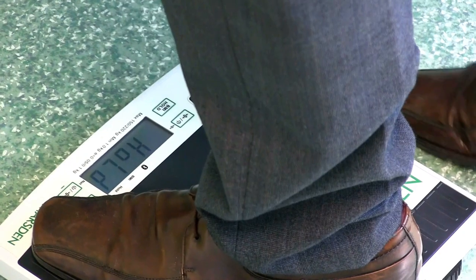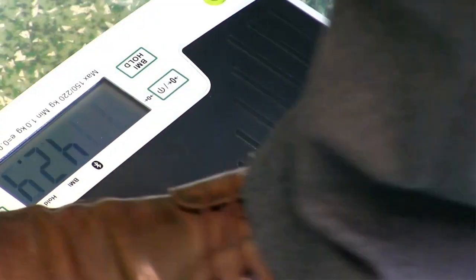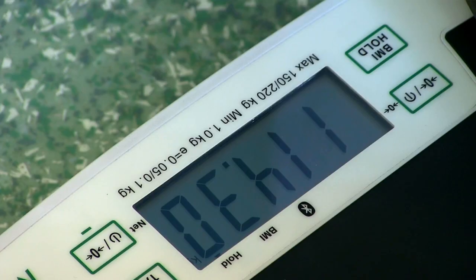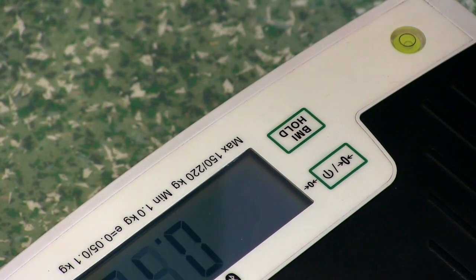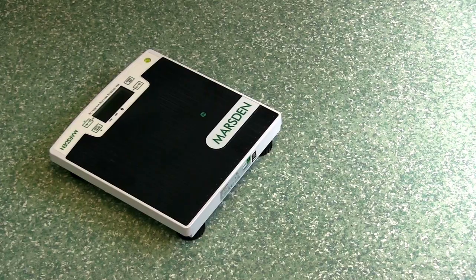Press the BMI hold button once. Have your patient stand on the scale. The patient can then stand off the scale once they've heard the beep. Once they've stood off the scale, the LCD display will alternate between showing the patient's weight and the patient's BMI. To disable this function again, just press the hold/BMI button once and it goes back to its standard weighing mode.